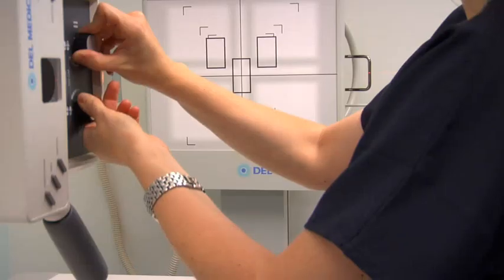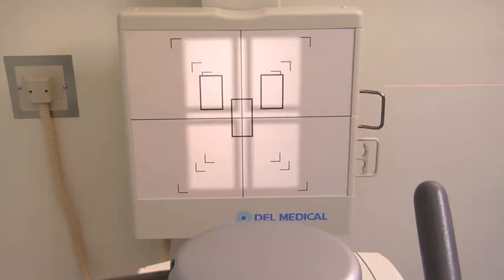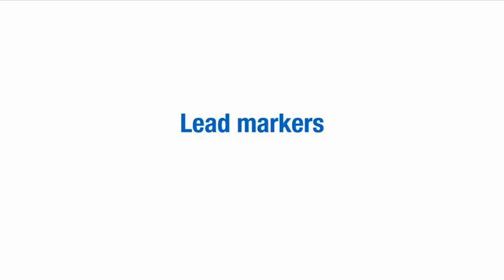Collimation limits the area of radiation administered to the patient and also reduces the amount of scatter radiation reaching the image receptor. Accurate collimation reduces patient exposure by limiting the size and shape of the X-ray beam to only the area to be visualized on the image receptor.